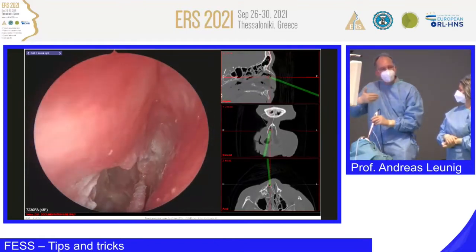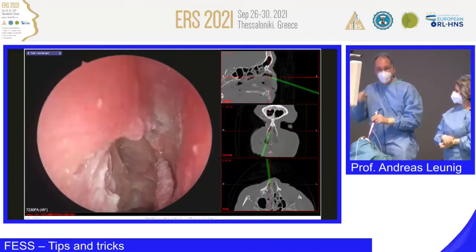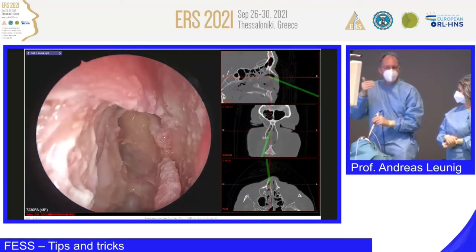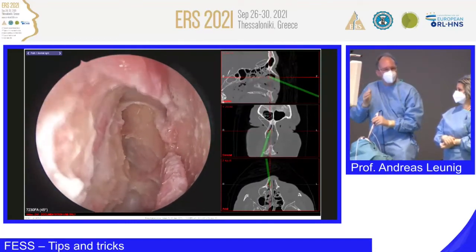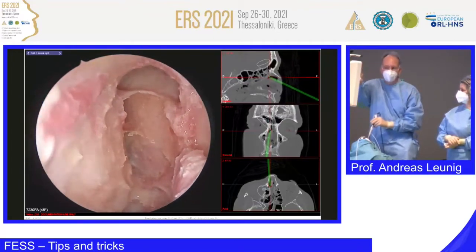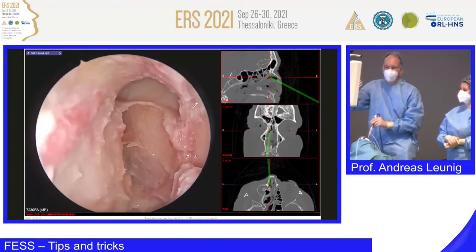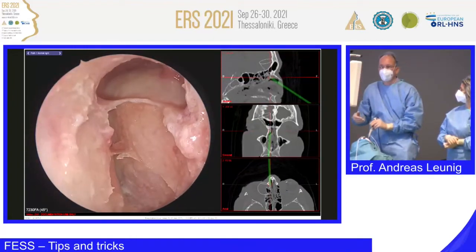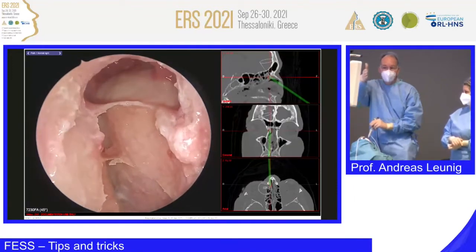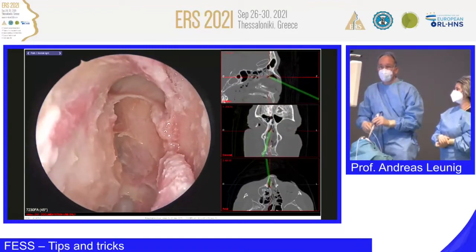It depends on the case. I can't say it's always possible, but in many cases it is. And what I have done here, yes, of course, I tore mucosa, and in a surgical case I would not do it, but here, to understand the anatomy, the relation between the artery, the skull base and the frontal recess, I think it's necessary, otherwise I wouldn't be able to show it. As you can see, you can take these bony lamellas away as well, and then you get a wider opening.